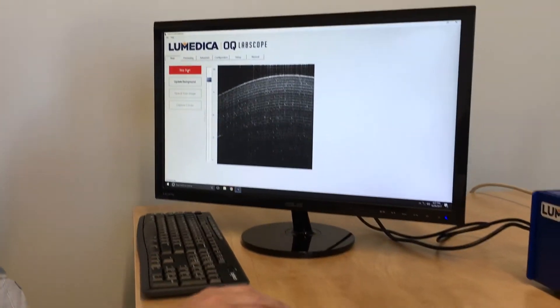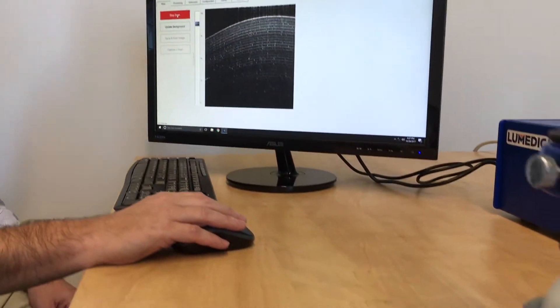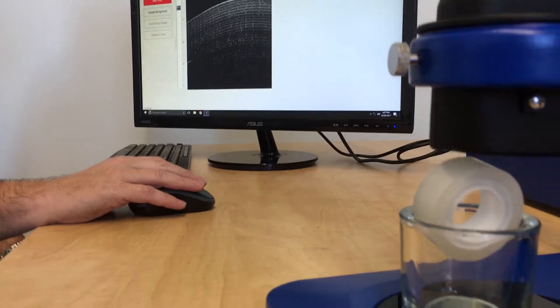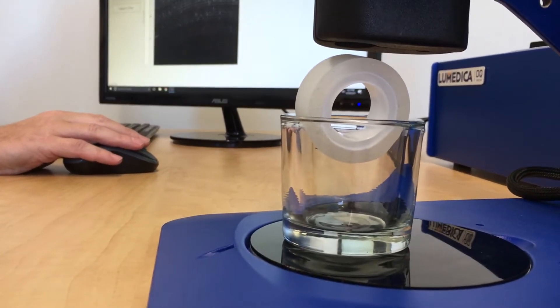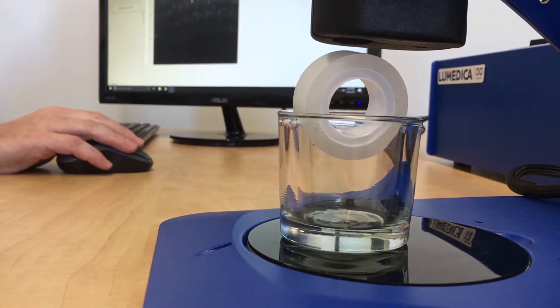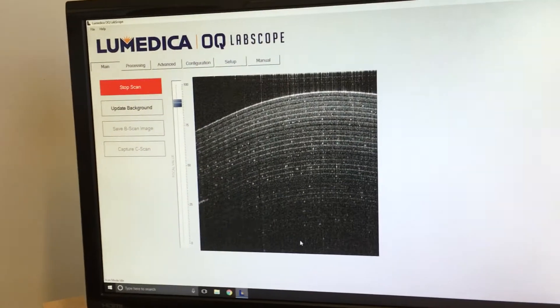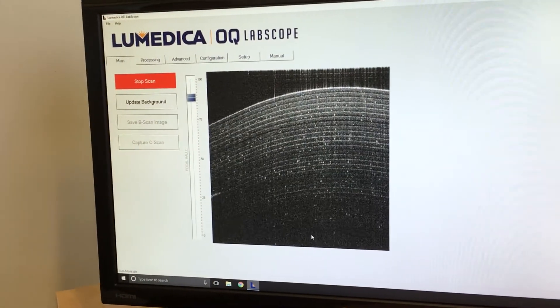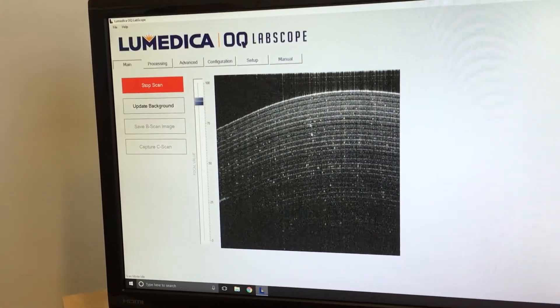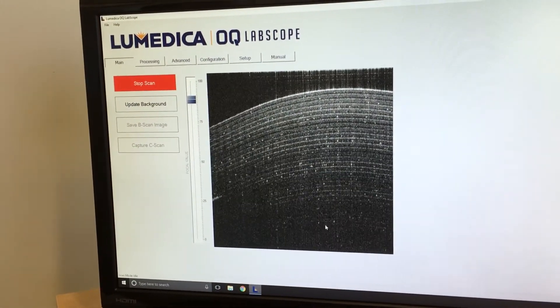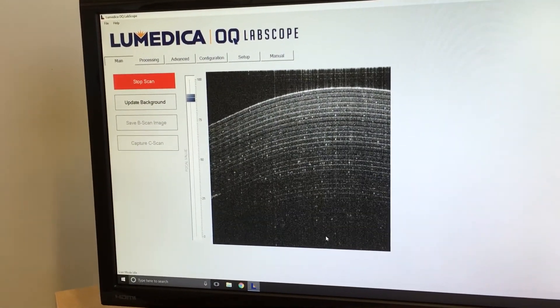I'm showing an image here of scotch tape, but this is a cross-sectional image, so you can see all the different layers of the tape. Our depth of focus here is over 2.2 millimeters, and we can see up to 20 layers of tape.